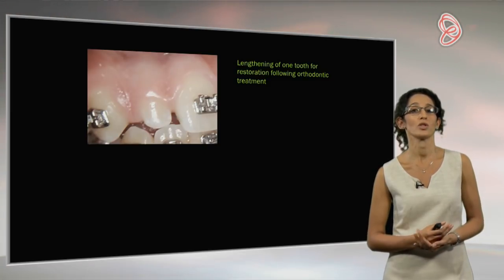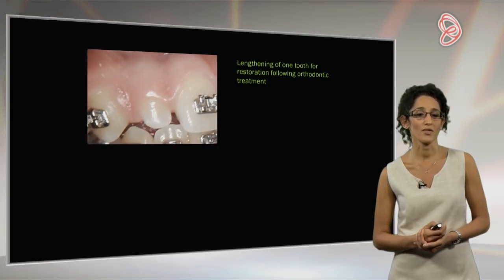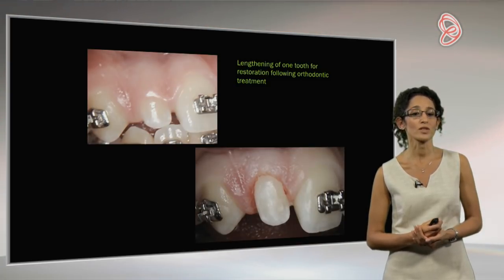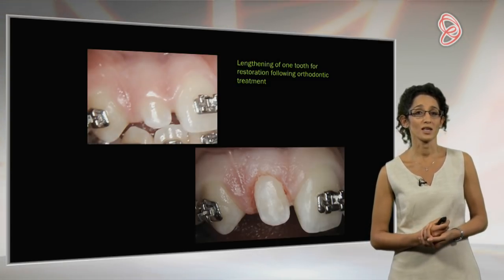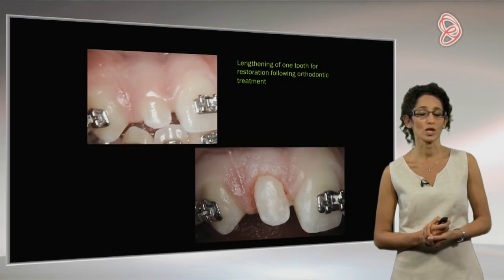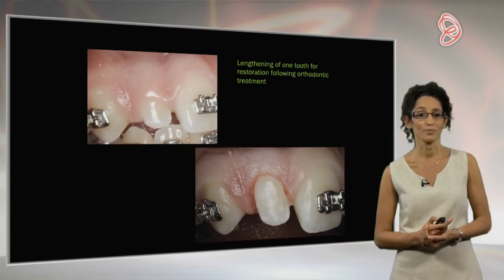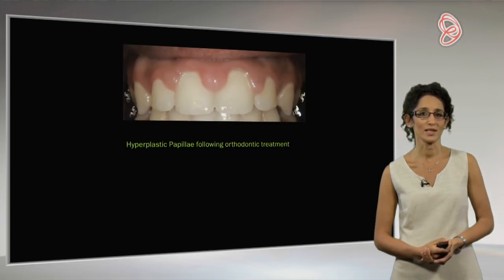You can see how low the gingival margin is, so she needed that increased. She ultimately wants to have a lovely smile, and this tooth was then going to also be built up with composite and perhaps ultimately a veneer. So this is how it looks immediately afterwards. We've just used a bit of topical anaesthetic in this case, and managed to get away with doing a gingivectomy and reshaping, and then she went on to have the tooth restored the very next day, because as you can see, very, very little bleeding there. So I'm starting to build a picture for you of the advantages with how we use lasers.